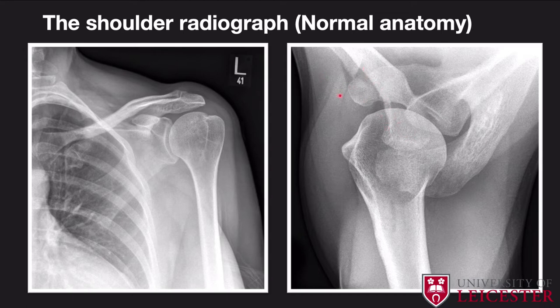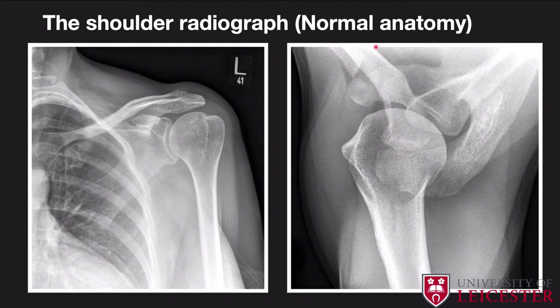On the axial view you've got the acromioclavicular joint. Work out which is anterior — the coracoid process is always the most anterior structure. Posterior to that you have the acromion. Once you've established where the acromion is, you know it articulates with the clavicle. This is the acromioclavicular joint — there's a tiny space because there is cartilage and an articular disc. Finally, the humeral head is articulating with the glenoid. Remember, you'd have labrum and cartilage within that space — this is essentially your ball-and-socket joint of the shoulder.